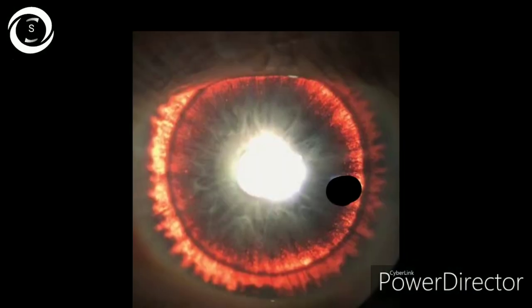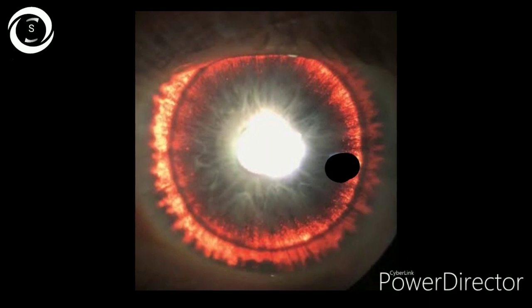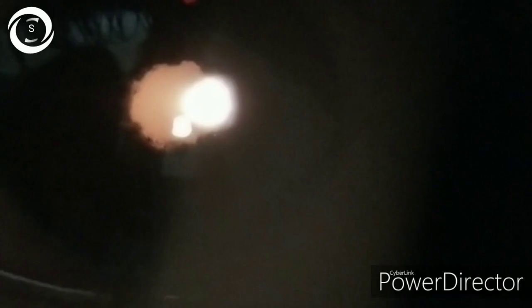Here ocular albinism is also highlighted. So it's an easy technique and it's a must-know technique. That's all about trans illumination of the iris. Thank you very much.